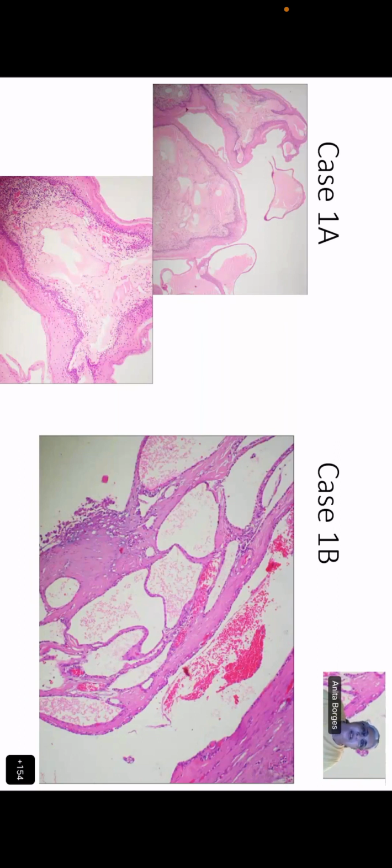So now is everybody agreed that this on the left hand side is not a secretion, or is it a secretion? Start from you, Divya, Adiya. No, ma'am. It is not a secretion. Vimi? Not a secretion. Suveta? No, ma'am, it's not a secretion. It is not a secretion.